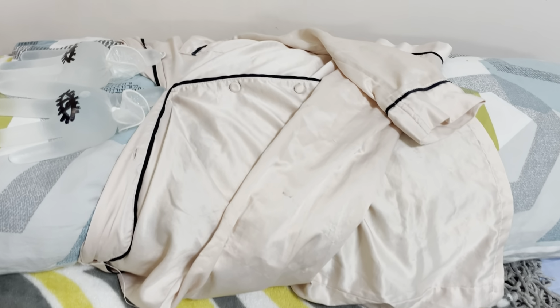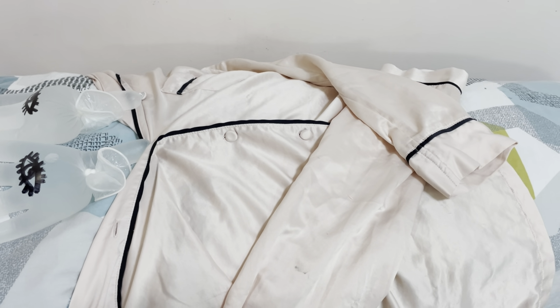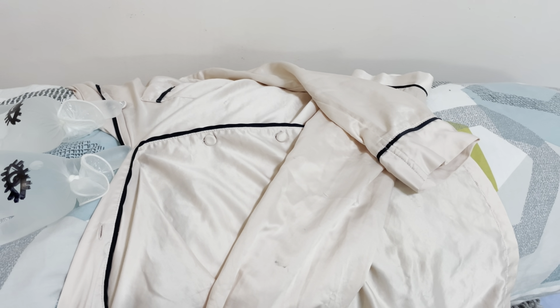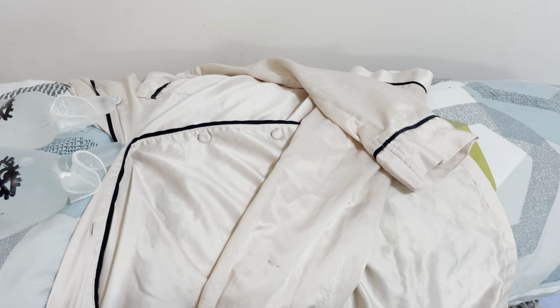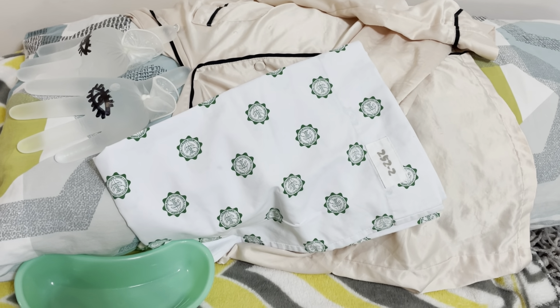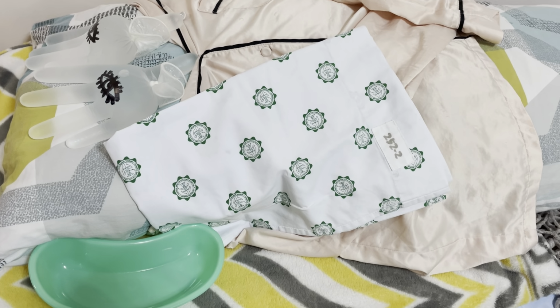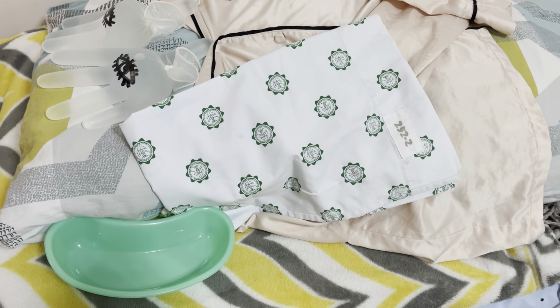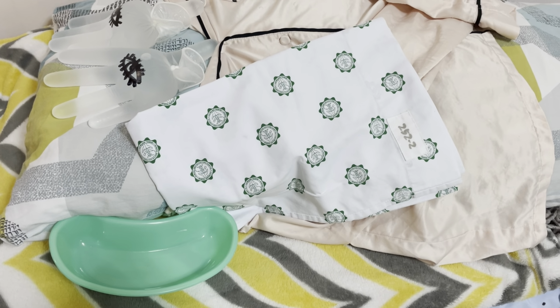The next step that we are going to do is we're going to place a towel just below the patient's face and the emesis basin just below the patient's cheek. This will catch the solution and foreign body being irrigated. Placing the towel below the patient's face and also the emesis basin below the patient's cheek is so important because this will catch the solution and foreign body being irrigated.